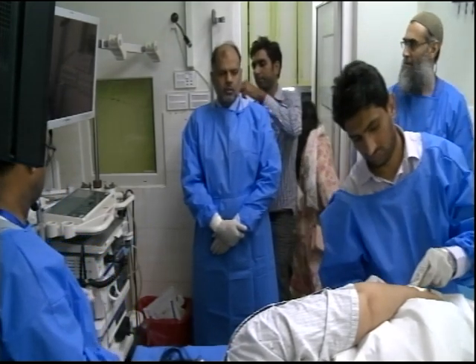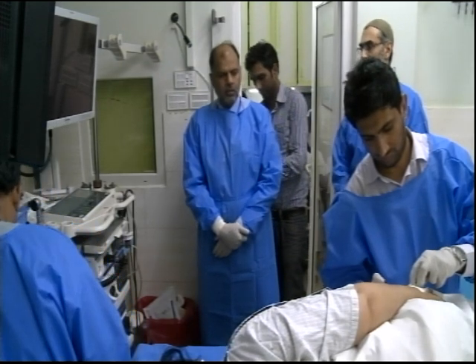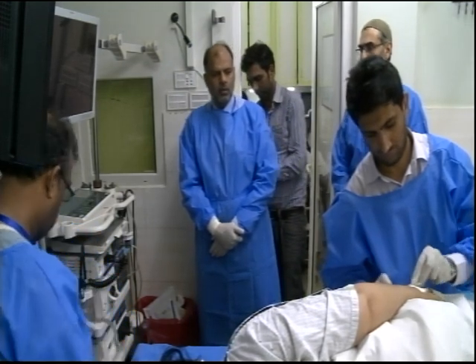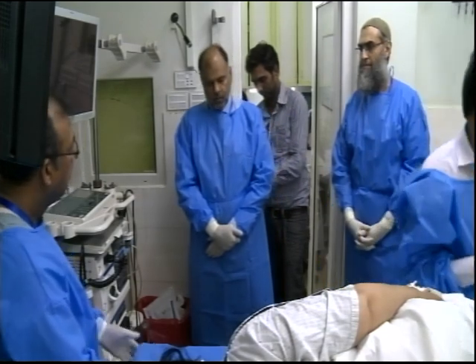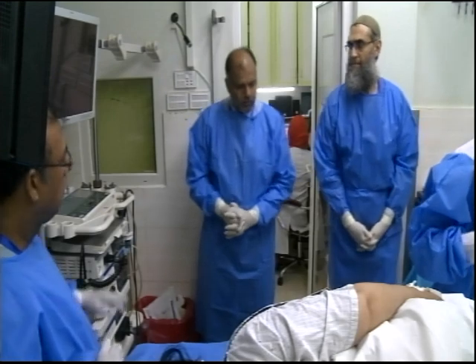Okay, for the audience, we are suspecting that this patient has a submucosal lesion in the stomach. So any comments, how should we evaluate and what should we be looking for?